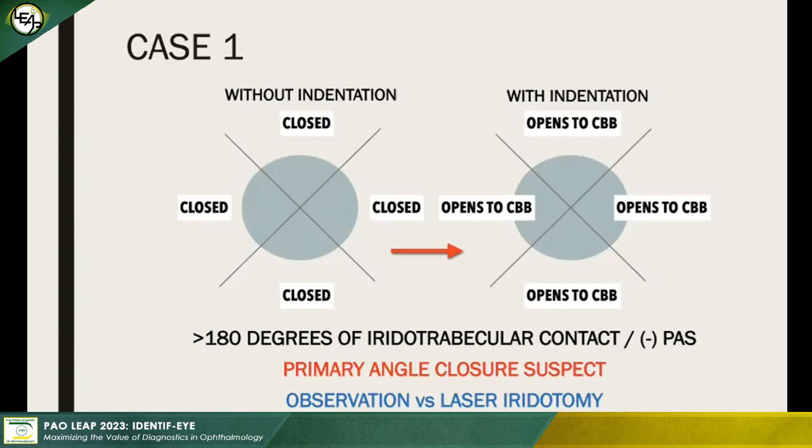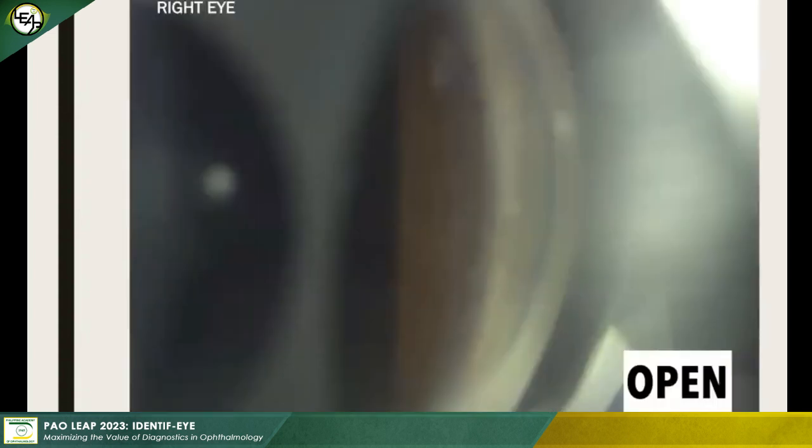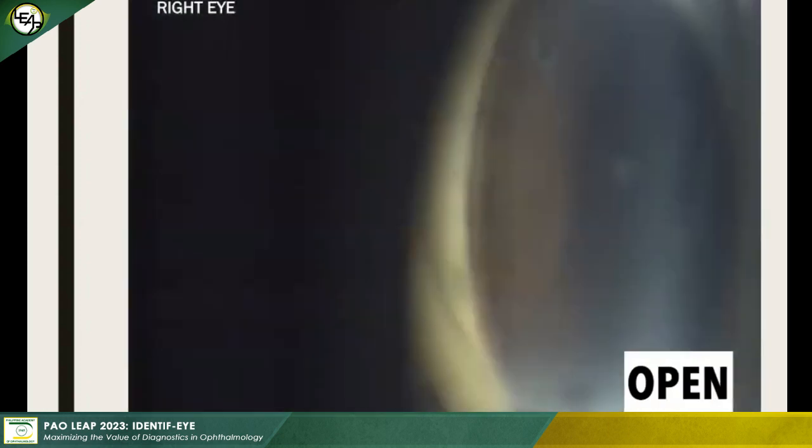If gonioscopy was not performed, we wouldn't have known whether this patient had angle closure or open angles. We wouldn't have known if laser iridotomy would have been needed. If we just presumed that this was an open angle, we wouldn't have been able to provide the necessary laser iridotomy that this patient needed. So after iridotomy, notice how the angles have been opened up to CBB even without indentation.